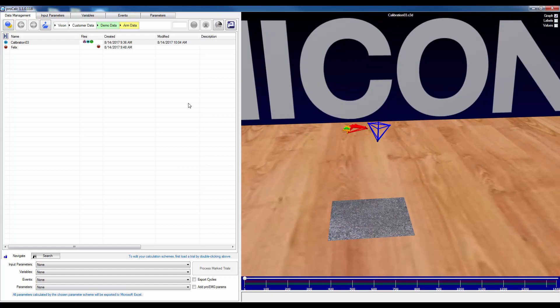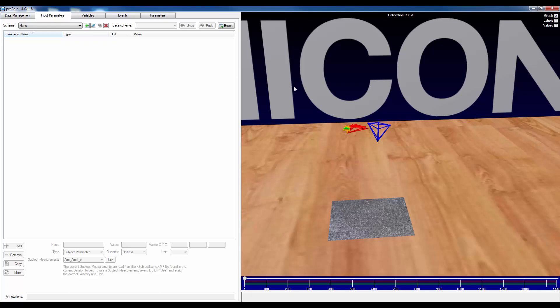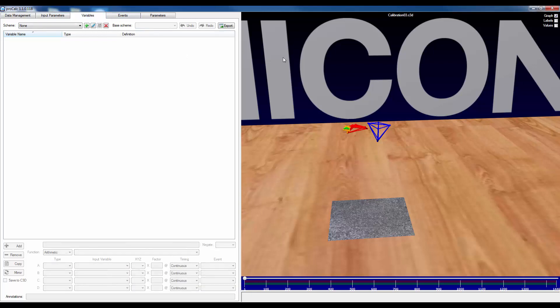In order to access the next four tabs, you will need to have a trial open. The first tab is input parameters, and this is any static or constant parameter that you want to include as part of your model, such as a leg length or an arm length. It can also be read from the MP file that was saved in Nexus. The next tab is variables, and this is where you're going to spend most of your time, as most of the calculations will be performed here.